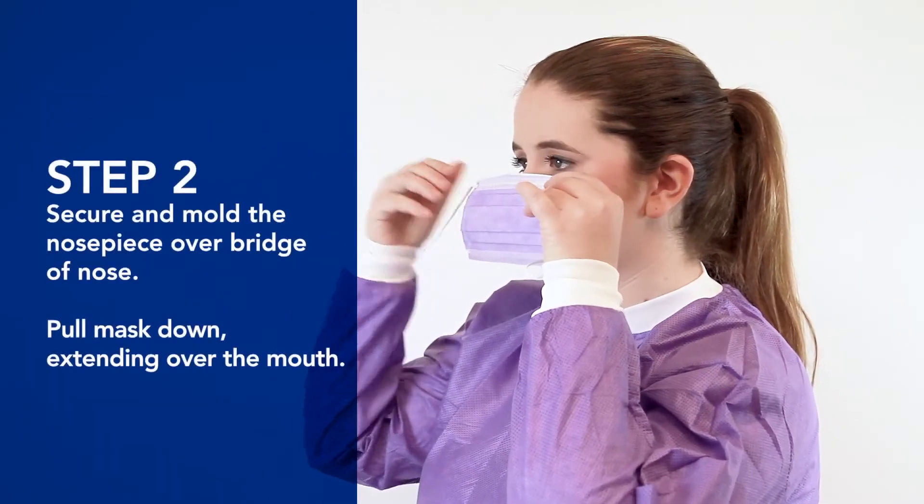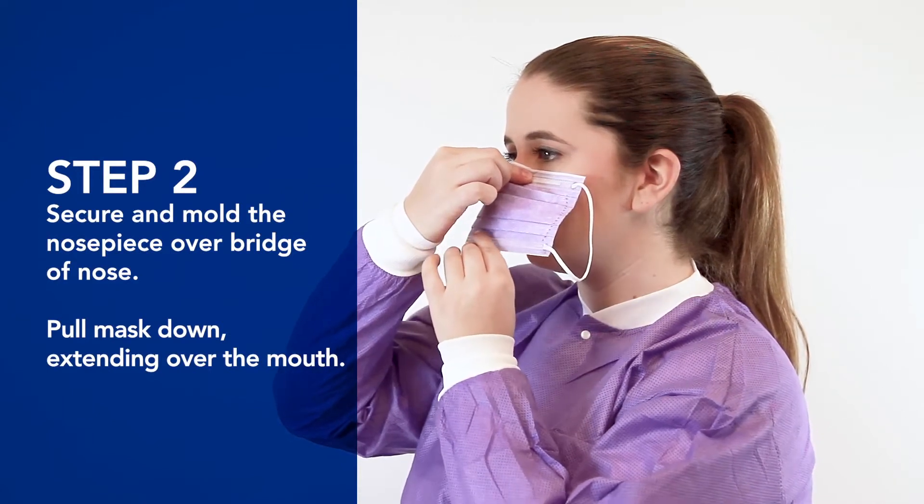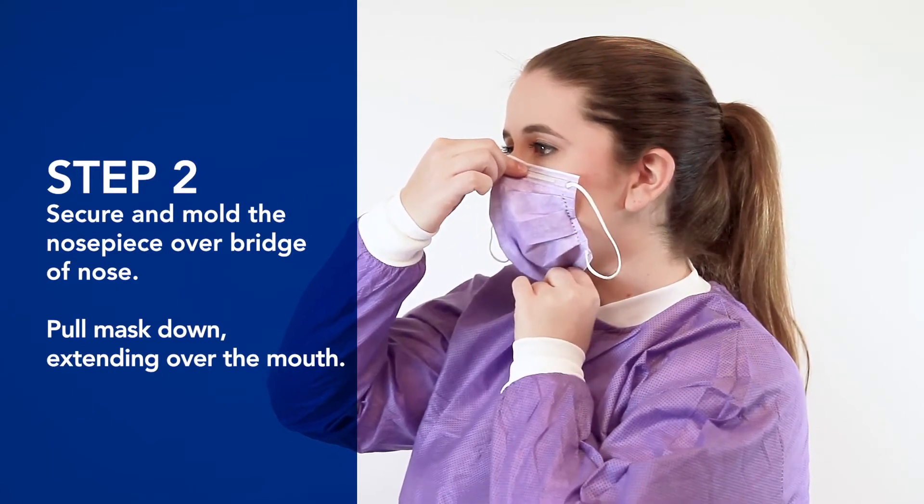Step 2: Secure and mold the nose piece over the bridge of your nose. From the bottom, pull the mask down, extending it over your mouth.